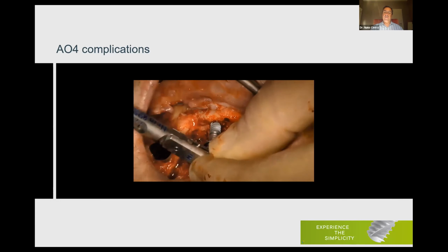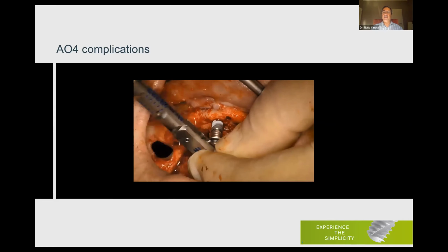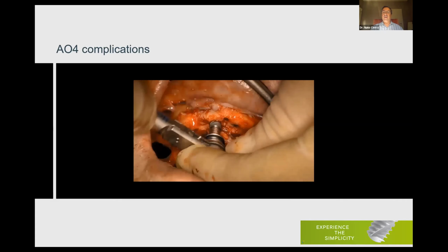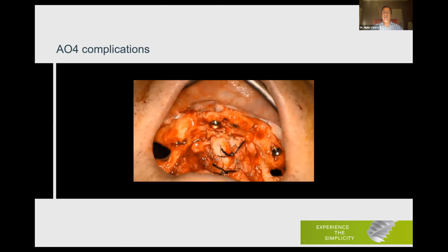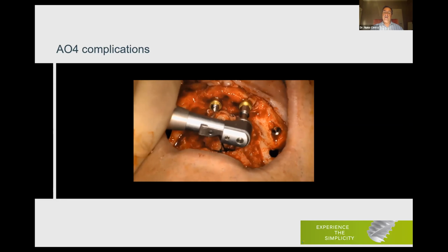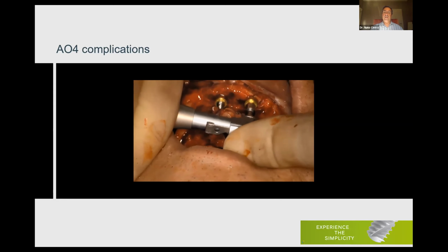And as I said before also, I like to finish the position of my implant by hand. As you can see, again, the hydrophilic property, the implant is already attracting blood, and I'm applying more than 50 newtons for sure. Okay, so the anterior implants are placed, and then we go for the abutments. For the posterior ones, again, we will use the guide. The anterior ones are just straight multi-unit abutments. We don't need the guide.